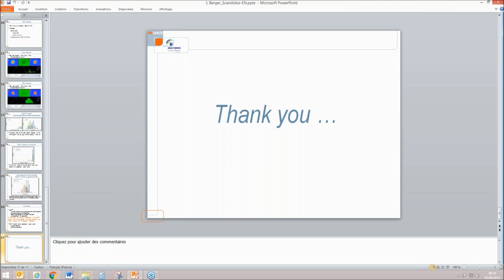Every day we use PDIP because it's very simple and fast. But if we have something wrong or PDIP is not under the tolerance, we put the Delta4 on the LINAC, and this is our reference in our center for every VMAT and stereotactic treatment.